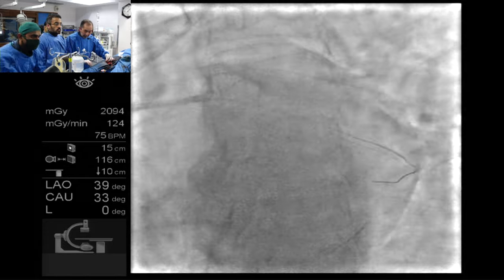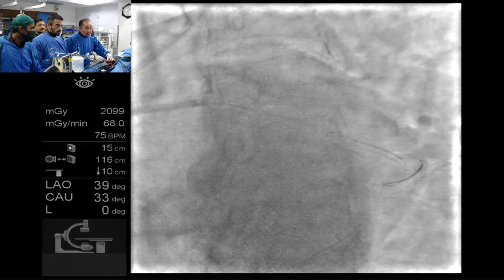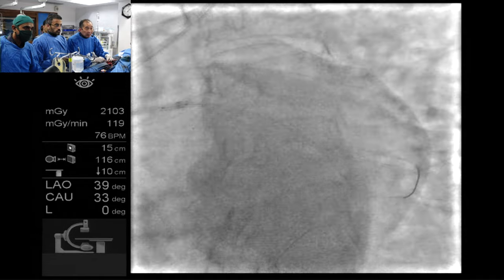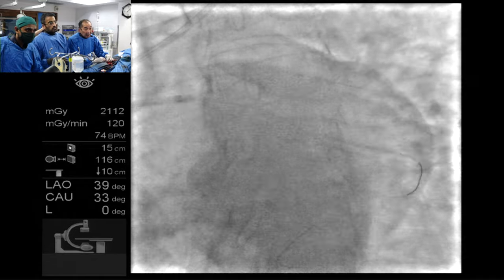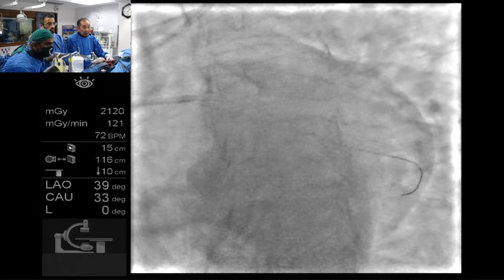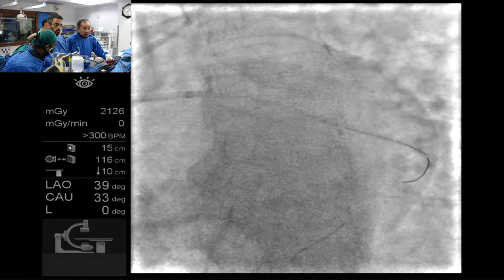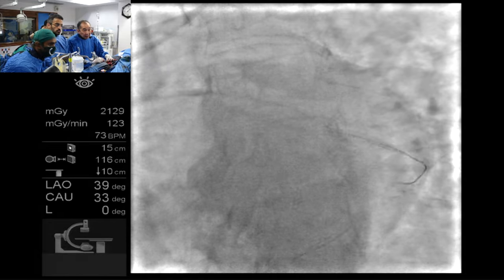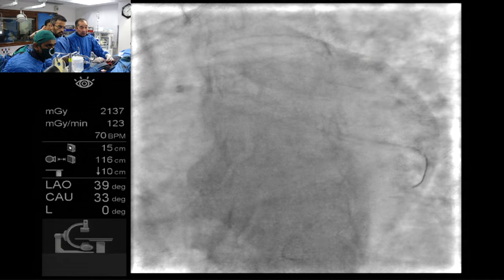Okay, good. And should we do a stent boost and see if it's anywhere close to the strut? Should we dilate and see? Let me try to anchor, right? Yes, that would be the best thing. Now anchor. A little more down and anchor. It's too close to the stent to anchor. Can we go down? Go down. So, let's anchor. Okay, good, anchor.